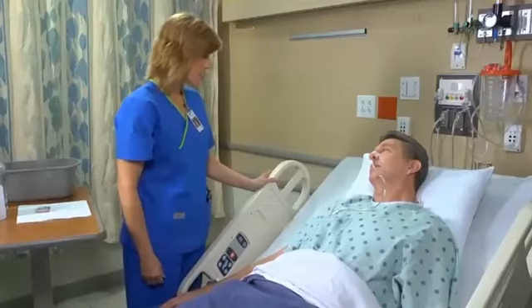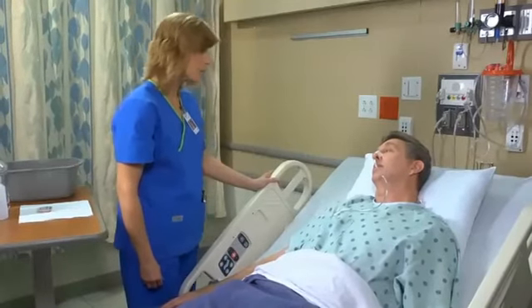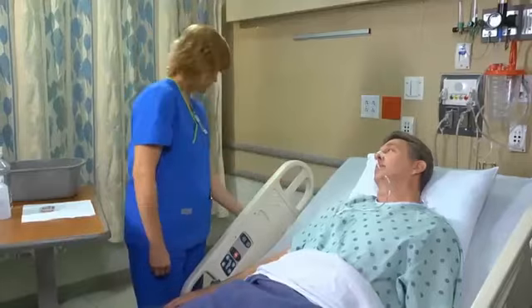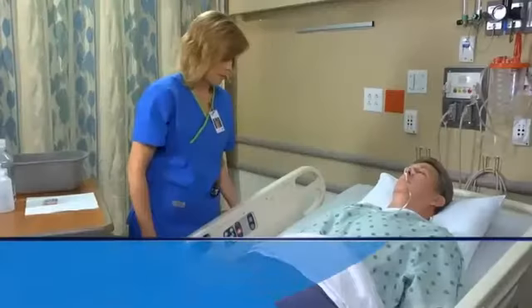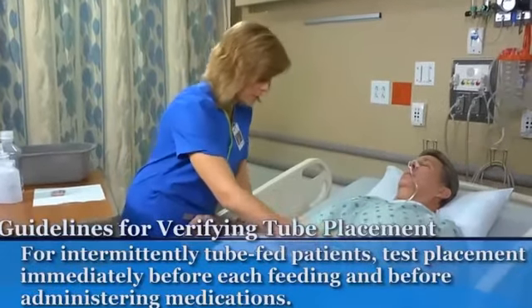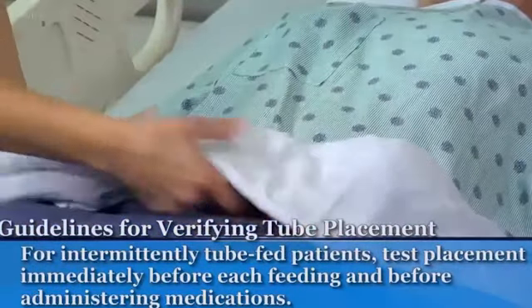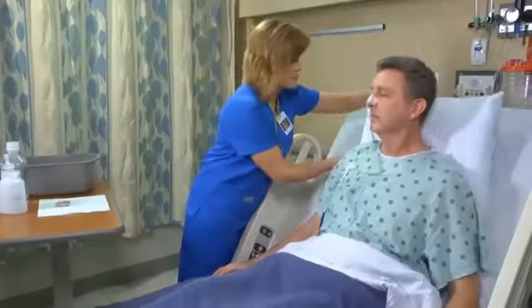Ask him if he has any nausea or abdominal pain and auscultate his bowel sounds. Suction should be turned off before checking bowel sounds. If the patient is receiving intermittent tube feedings, check tube placement immediately before you begin feeding the patient or administering medication through the tube. Okay, let's adjust this pillow for you.